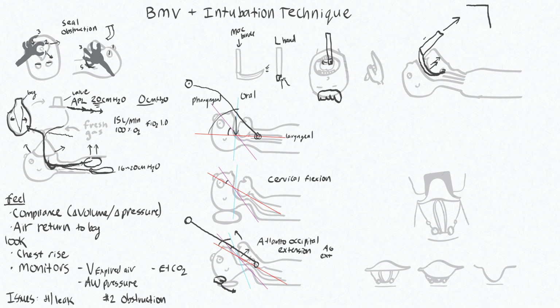What you don't want to do is rock this back. Do not do that because the patient will have upper teeth here, and you don't want these teeth to make contact with the metal blade. That would very easily cause dental damage, which we want to avoid.